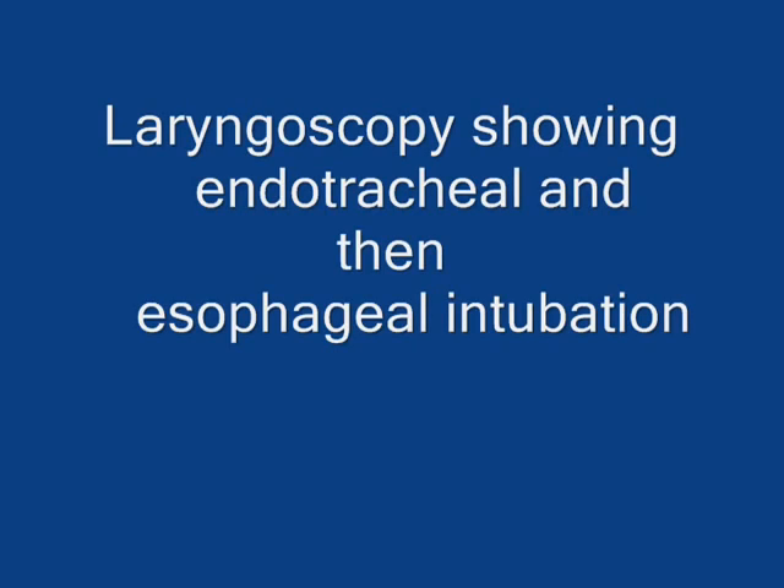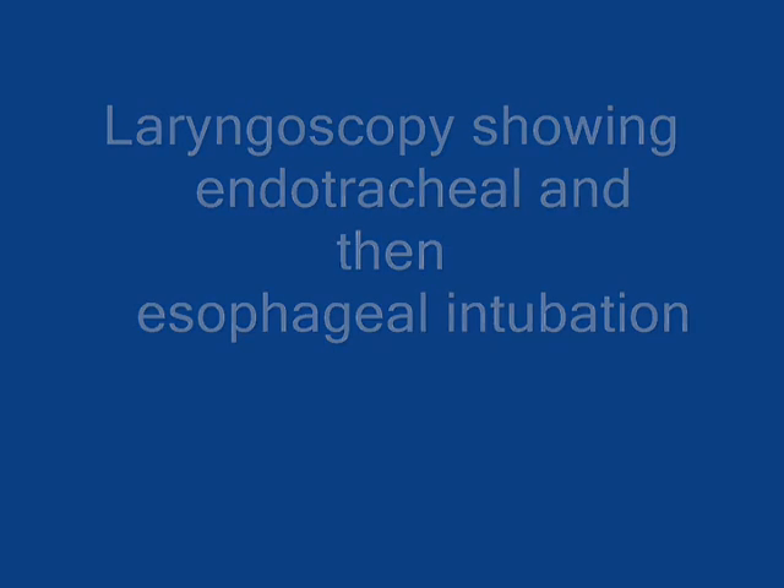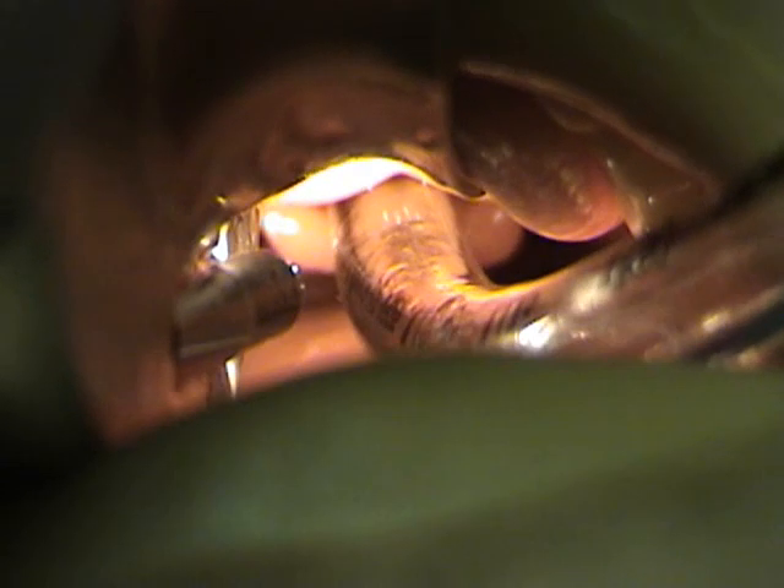We are going to show on endoscopy how the tube should look on a good intubation. You can see the arytenoids in the back and the endotracheal tube in position. Then another view of a patient with an esophageal intubation — you can see the laryngeal inlet at the top and then the endotracheal tube at approximately the 7 o'clock position at the very bottom of the view.